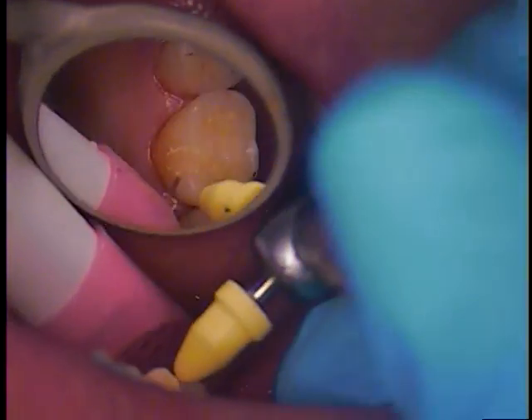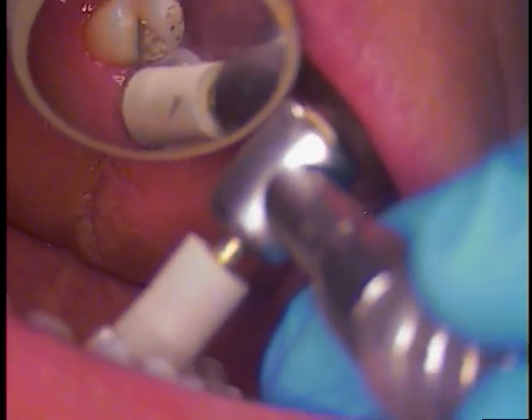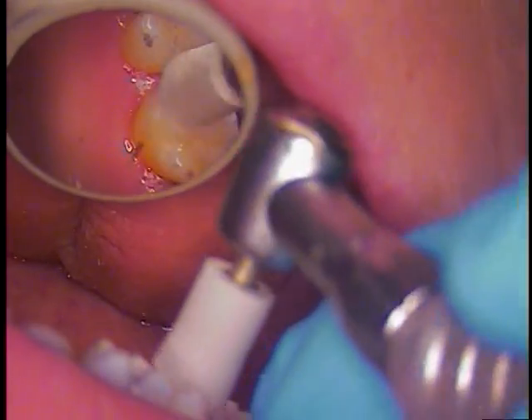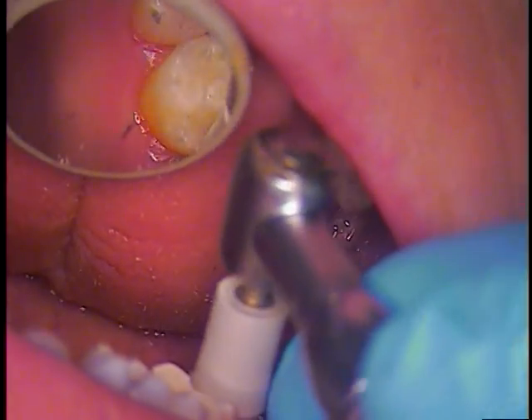I'm kind of finished with that point. Now there are cups that you can get. I'm going to bring a cup in next — it's a gray color cup, the middle grit. So this is like medium, and I'm just polishing like a prophy cup, coming in and polishing like that.